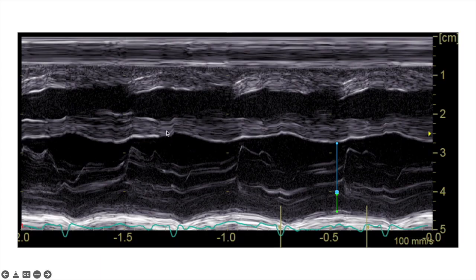You will then come up with this M-mode view, showing the cavity of the RV and the cavity of the LV with the interventricular septum in between. We can easily measure the left ventricular dimension during systole here, and also the posterior wall thickness during systole.